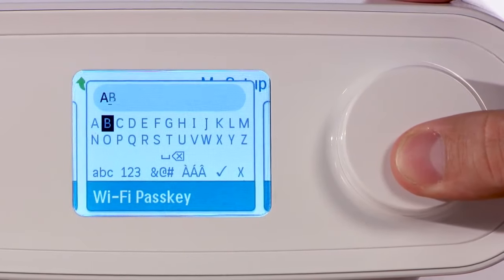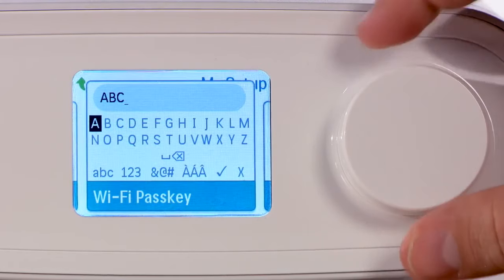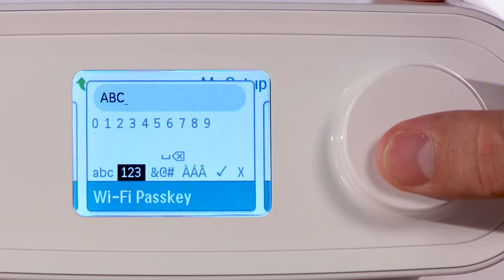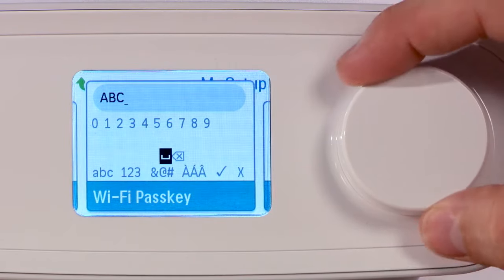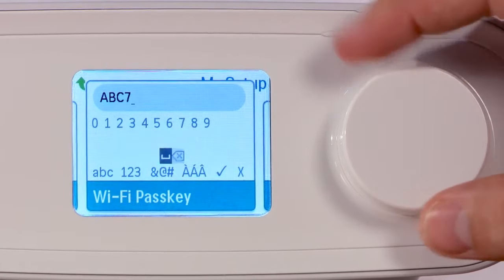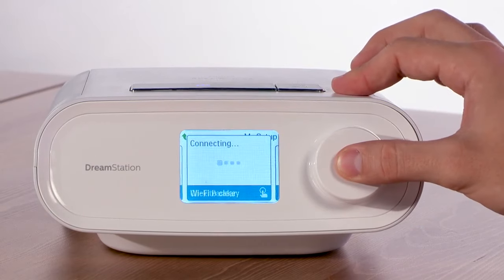Enter your network password one character at a time. Turn the control dial to move to the next character, then press the control dial to select it. Note the selections for upper and lower case letters as well as numbers and special characters. After you have entered your password, scroll to the check mark and press the control dial to input the password.